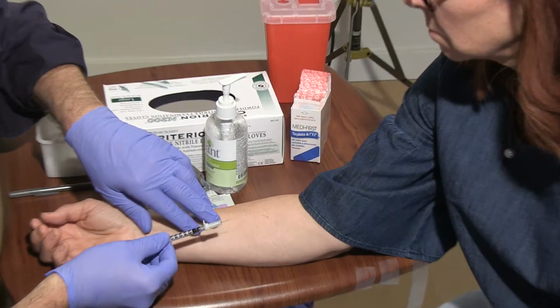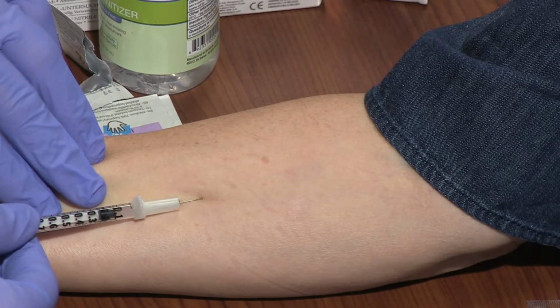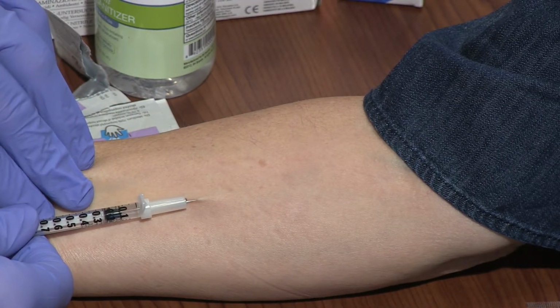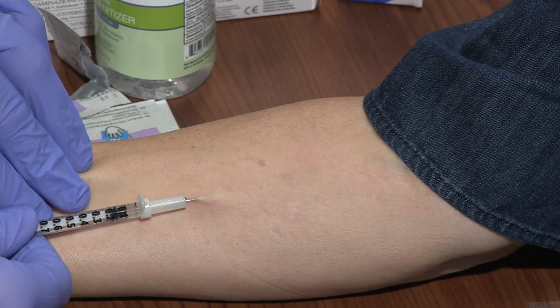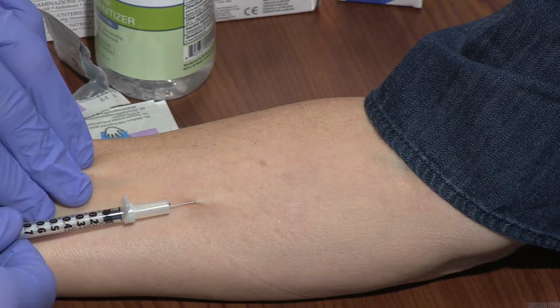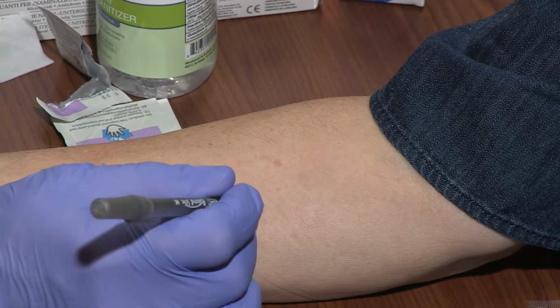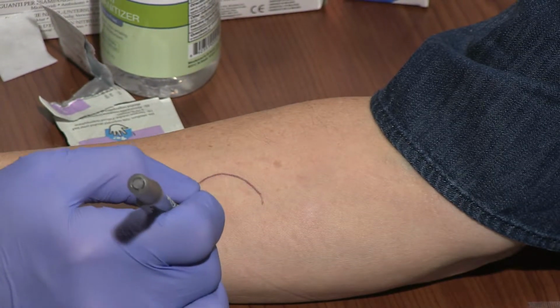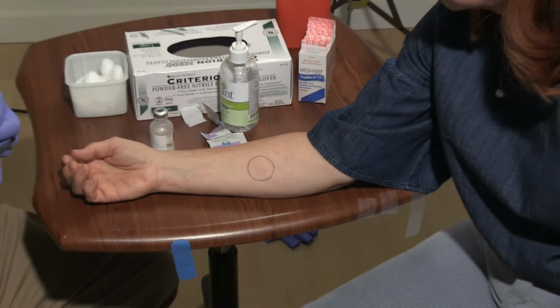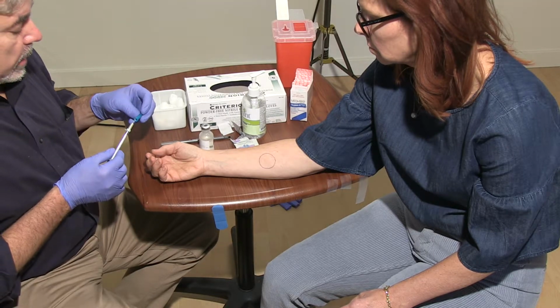I'm going to go bevel up right under the skin at a 15-degree angle. Once I'm under the skin, I'm going to track in right under the surface of the skin. I'm going to raise a small bump of tuberculin fluid, draw my needle, and where that small bump is, I'm going to draw a circle around it so we can measure the amount of induration in 48 to 72 hours.